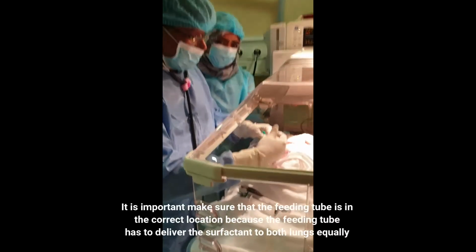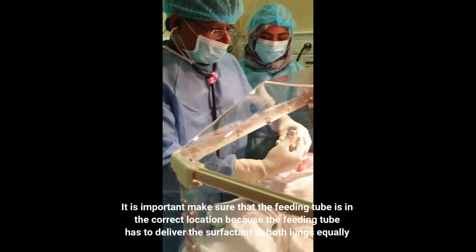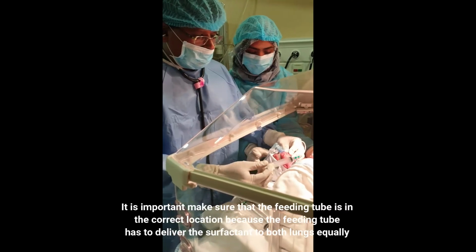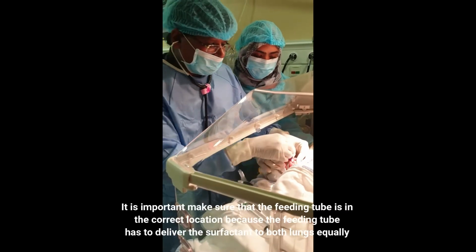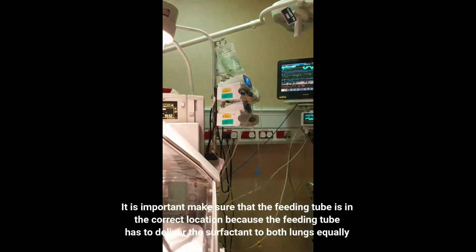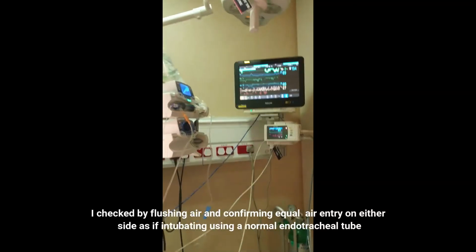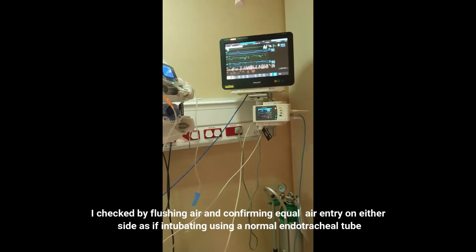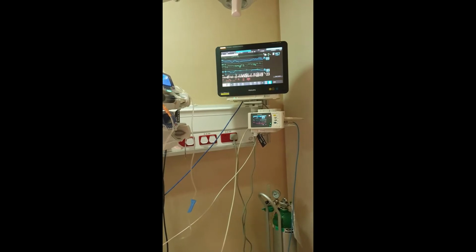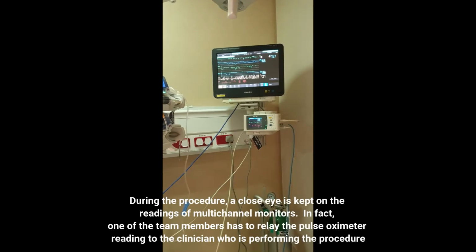It is important to make sure that the feeding tube, once it passes the glottis, is in the correct location, not entering the lung. Preferably, it should be in the position just above the carina, as in a normal ETT, so as to deliver the surfactant to both sides equally. This is ensured by flushing air and confirming equal air entry on either side, as in the normal procedure of checking the position of an ETT, as you would do in an intubated baby. During the procedure, a close eye is kept on the readings of the multi-channel monitors.